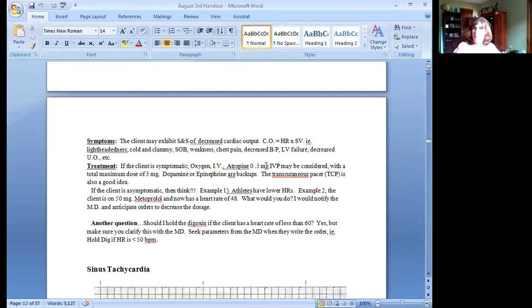Please leave me a patent IV. Check your IVs before you leave, particularly if it's a central line, if it's a right IJ triple lumen or a left upper arm PICC line. 3 lumens, every lumen, every time, two-way street. I want it to flush and give me a good blood return. Never leave your shift without making sure your lines are patent, because when your colleague is going to need that line, they need it to work. They don't need it to be occluded.